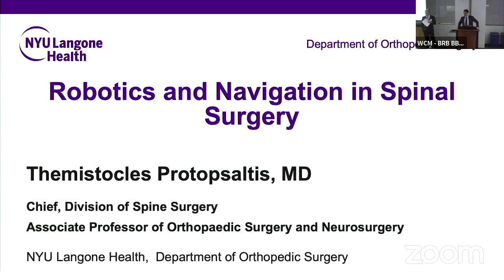Accuracy can change if we use pre-op CT plus 2D fluoro versus 3D fluoro or O-arm. So is the accuracy different between these systems? I've used O-arm, Airo, Ziehm, all these systems, Stealth and Brainlab. I've used those systems the most, and that's what I'm most comfortable with. And I think that they're both excellent.